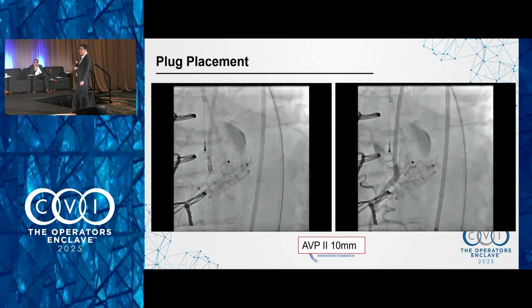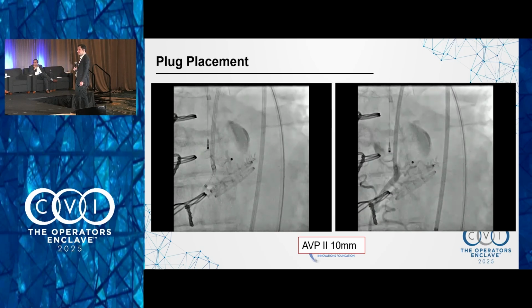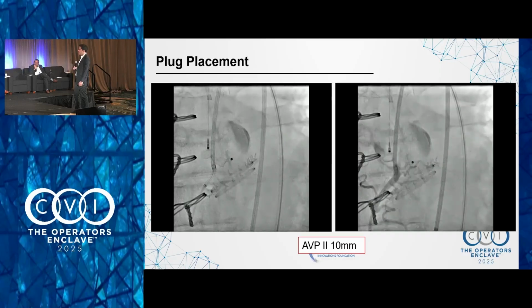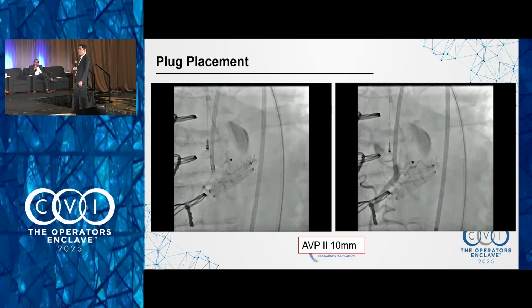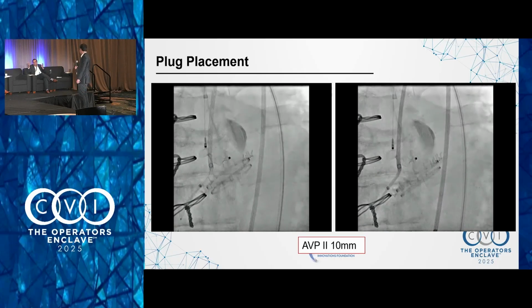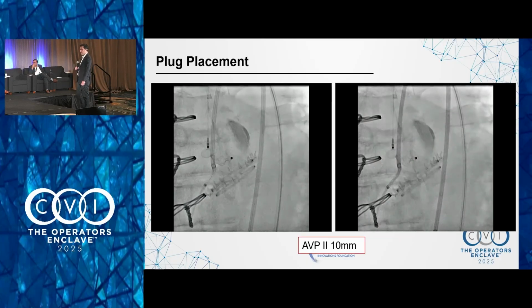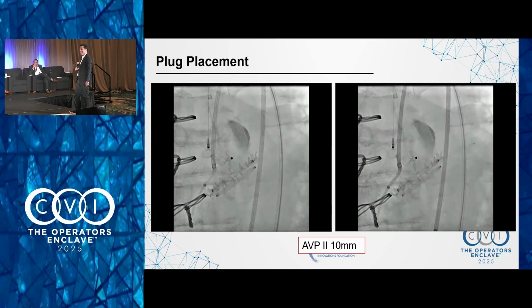I didn't know what you had asked. So the reason I did not want to release it completely is because I didn't know, if I were to deploy the stent, how it was going to interact with the device. So you would deploy the stent. Yes.